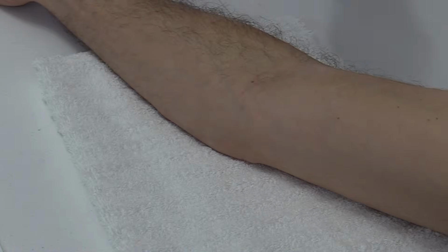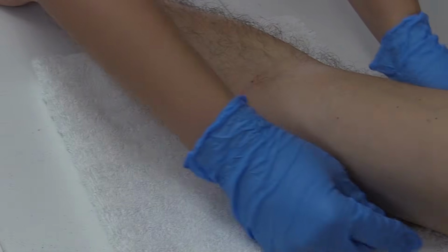So what I'm going to do is I'm going to use the antecubital area, the AC, the bend of the elbow, and I'm going to apply a tourniquet. You don't always have to apply a tourniquet. In some situations you wouldn't want to, depending on what type of lab result you're drawing, or if you have an elderly patient who has fragile veins.